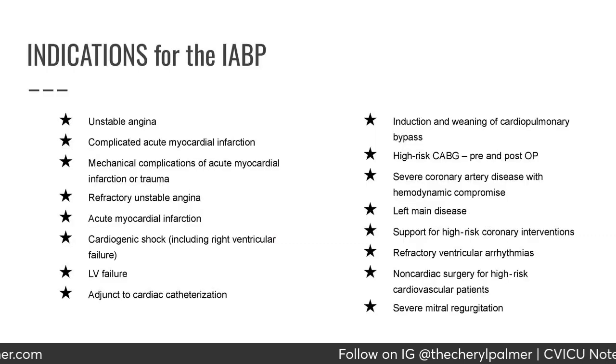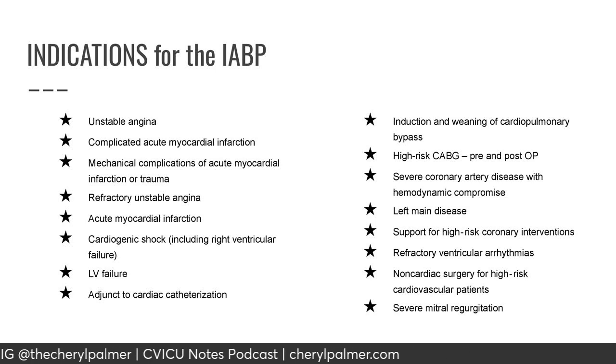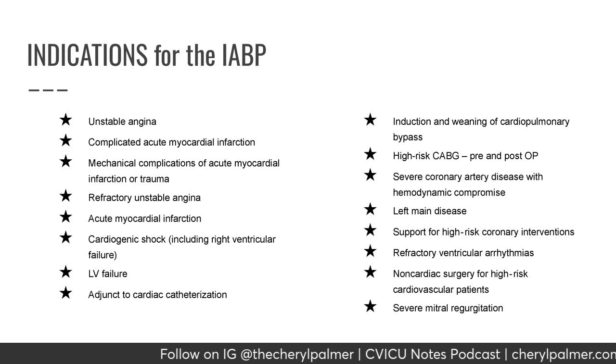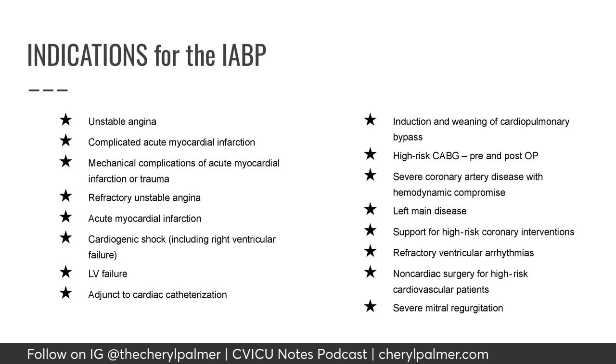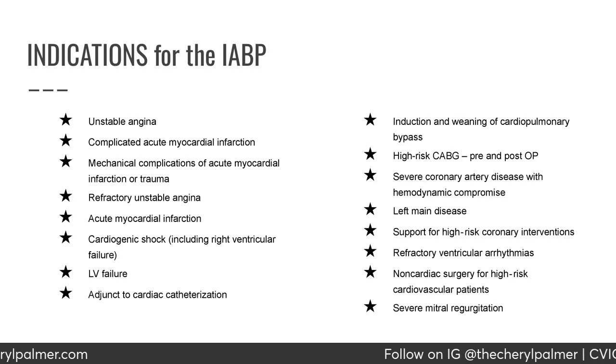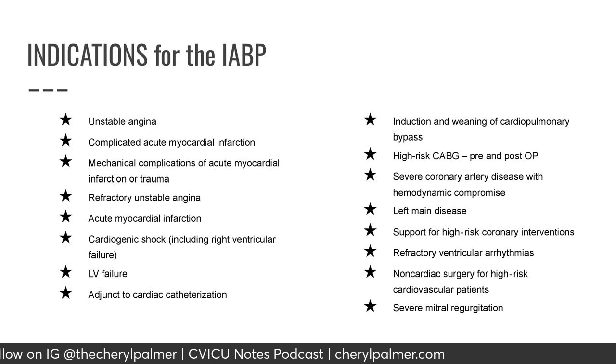Indications for the balloon pump. Here are some of the indications: unstable angina, complicated acute myocardial infarction or MI, mechanical complications of acute myocardial infarction or trauma, refractory unstable angina, acute MI, cardiogenic shock, including right ventricular failure, left ventricular failure, an adjunct to cardiac catheterization, induction and weaning of cardiopulmonary bypass.